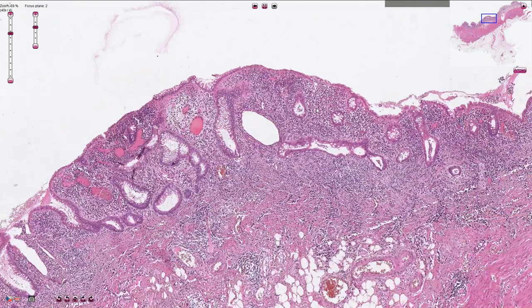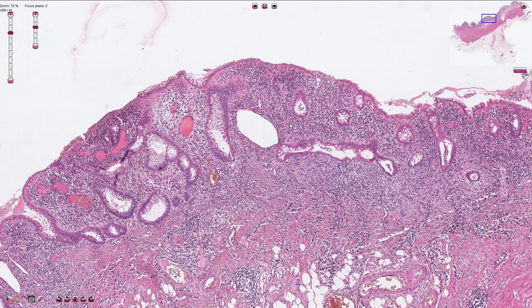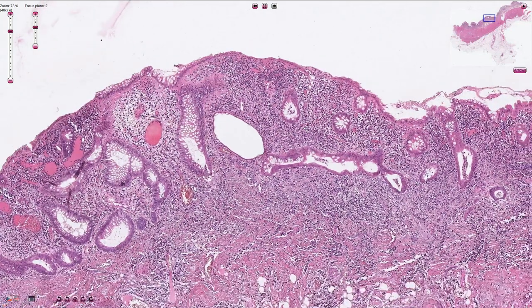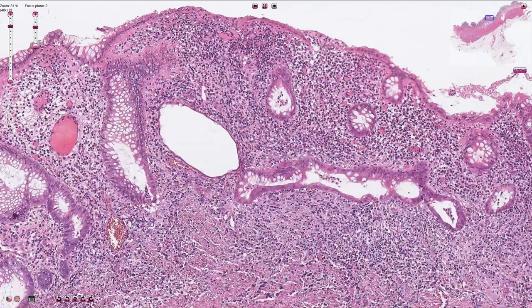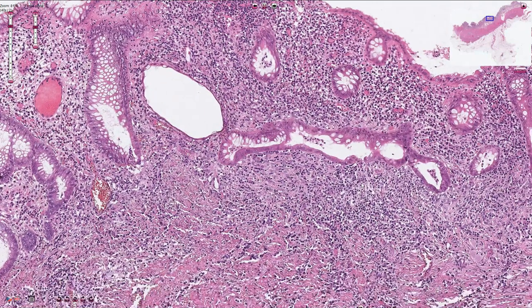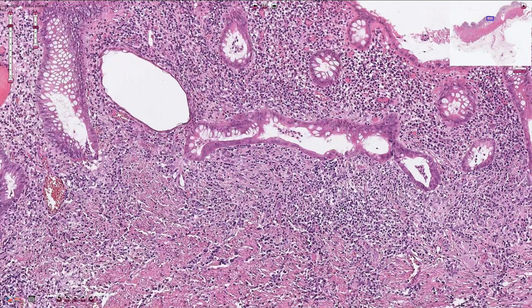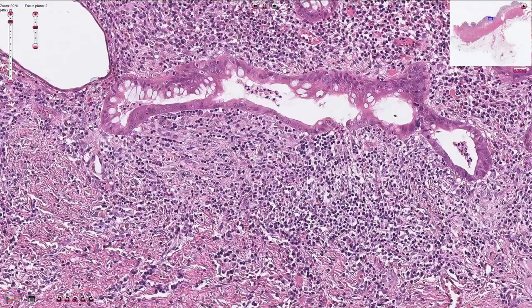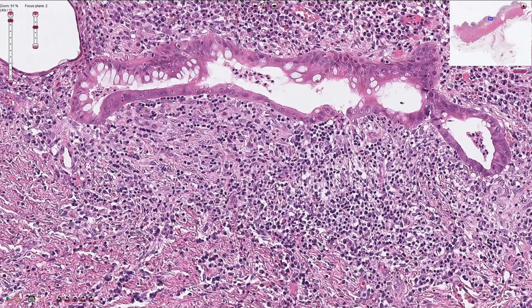Here we can see crypt dropout, or atrophy of the crypts. The lamina propria of the mucosa is infiltrated by lymphocytes and plasma cells. Typical for IBD is basal lymphoplasmacytosis, where the crypts do not reach the muscularis mucosae, and in the basal part of the lamina propria we can find a lot of lymphocytes and plasma cells.